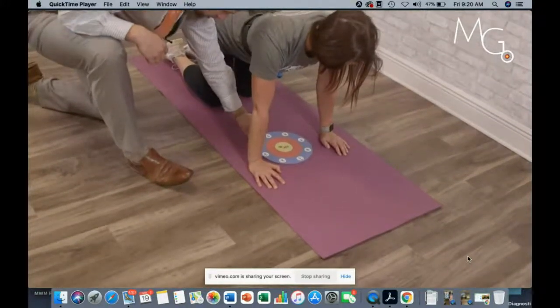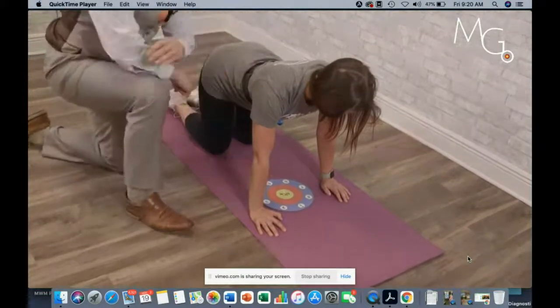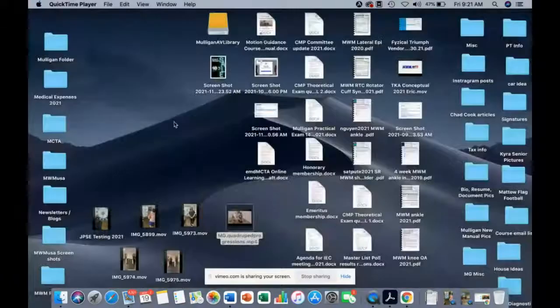This would just provide more focus on narrowing up their movement. And what I'm showing is the bullseye there. So that would definitely be, like I said, there's a lot of overlay there that could be considered a midline cerebellar activity. You can even have this with a line here on the ground, and they're crawling along, trying to see if they can keep their vestibular system working while they're not moving too far off the line. That can be a fun game also for pediatric patients, and getting them to be motivated to move and follow the laser, per se.